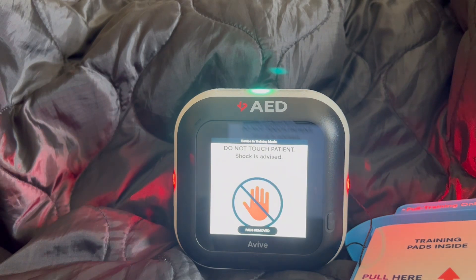Shock is advised. Move away from the patient now. Stand back.